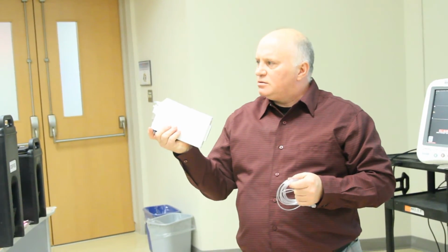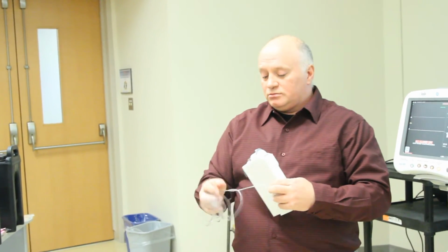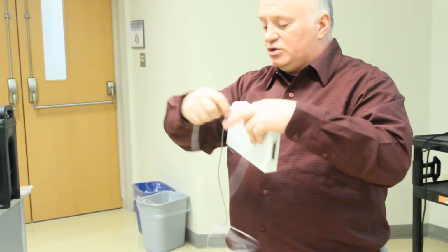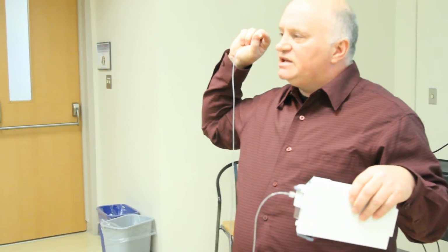Does that make sense to people? Okay. So then it's very simple. This goes onto the monitor. We connect a little tubing from there to however we want to connect it. We can connect it to a special set of nasal prongs, and the patient just exhales into the nasal prongs, and we get a waveform up. It is fabulous.